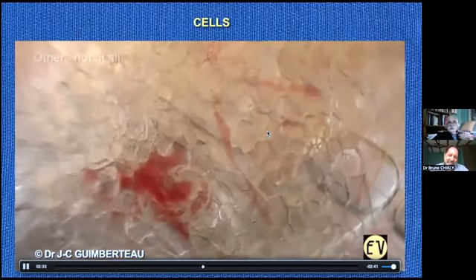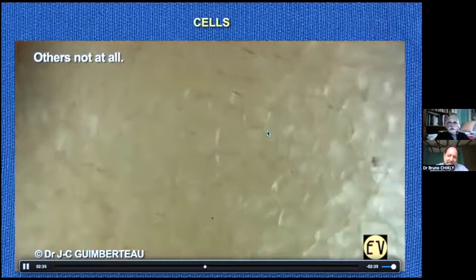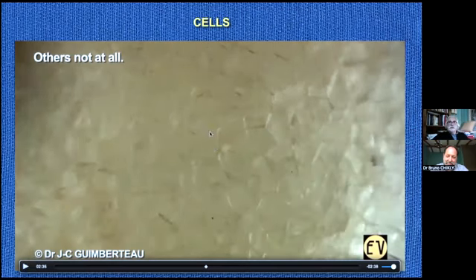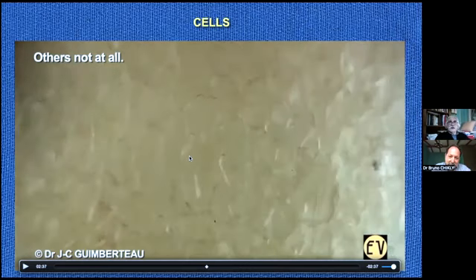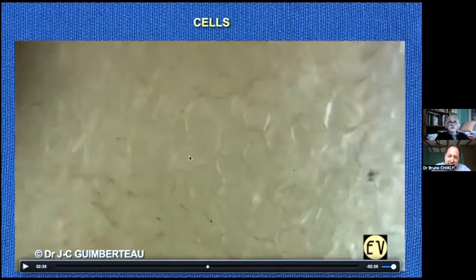And so, in some places, like here, you have adipocytes. These are adipocytes. You know, it's yellow. But you can't find any vessel. Every book shows an adipocyte so round, so nice. And here you can see more angles than usual, even. Look, this is totally adipocytes, all of them.